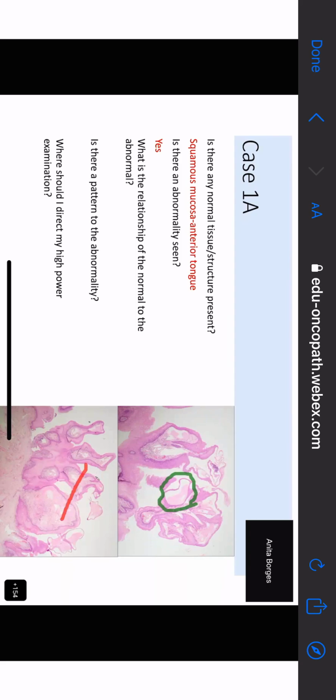And you think that they're intraepidermal? I'm cutting this thing tangentially like this. What will it show? Dia? Yes, ma'am. It will look as if it was in the epidermis, but actually it is in the subepithelium, right? So is it only some or all? All.